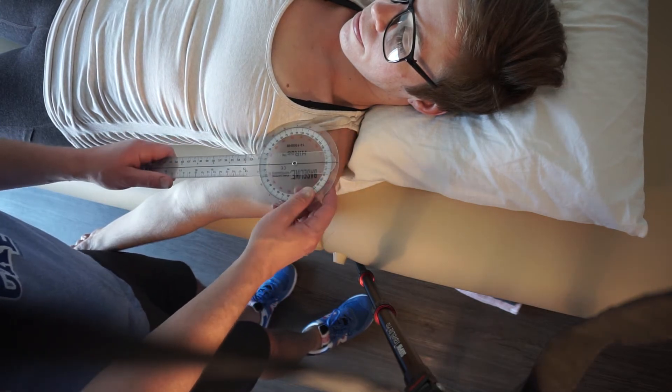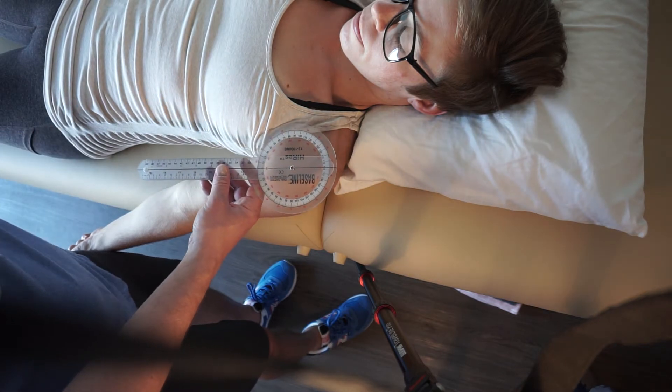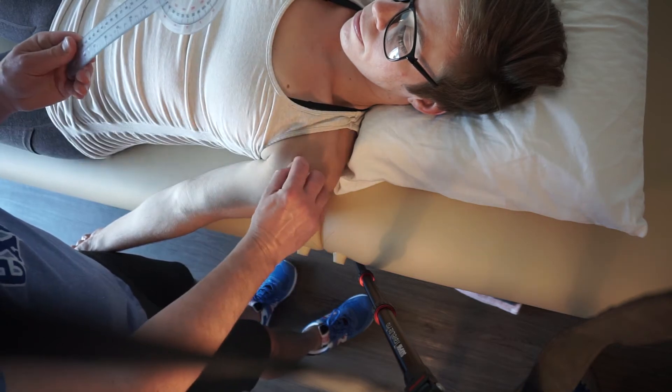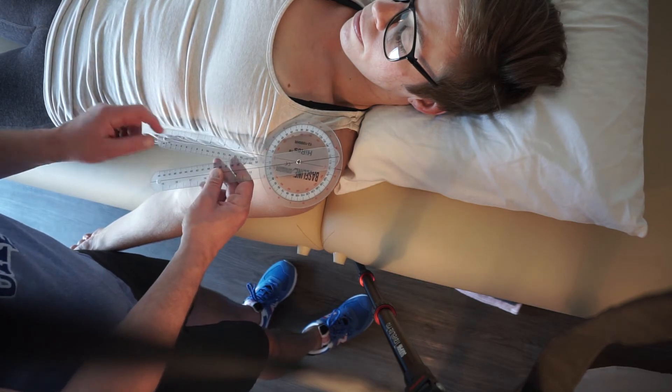You're not going to place it right on the skin but right over top of it. These shoulder measurements are really not too bad as long as you can manipulate the arm, because things just have to line up without pressing against the skin. A body pin can come in handy here — mark that spot so you can easily find it again.